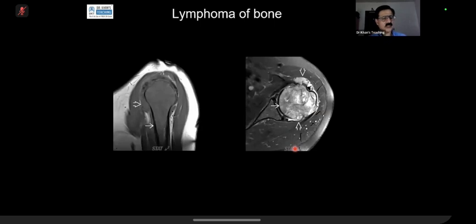Candidate 2, what are the key 2 sequences for marrow imaging? T2 and STIR. T2 is an incorrect answer. For marrow imaging, the key sequences are a T1 and a STIR. T1 and a STIR. And anything which is low on T1, because the fatty marrow is destroyed.